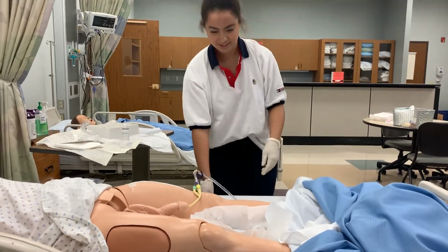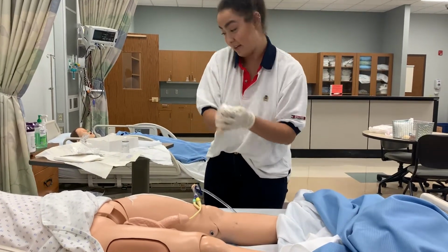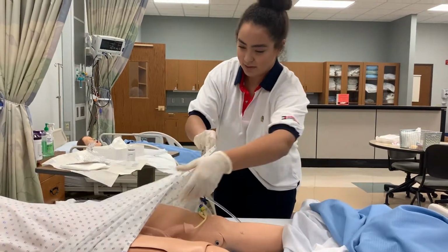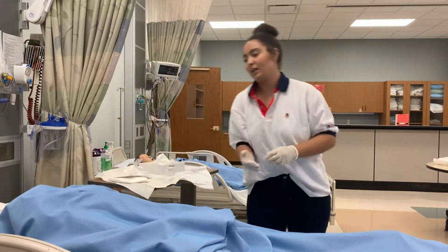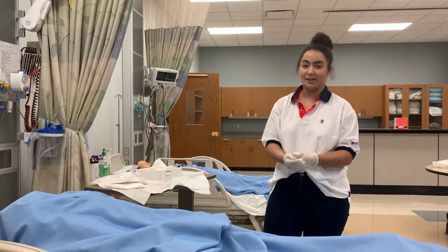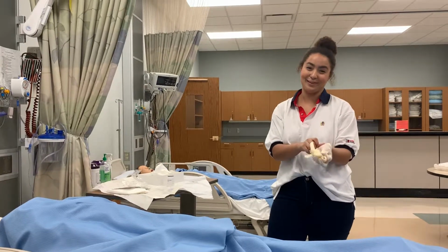All right, it's hung. All right, and I am going to clean up my space since I am no longer sterile. And I'm going to provide him with some privacy, and then I'm going to educate him on proper catheter care and how it's going to go. All right, that's it. I'm going to take these off for hand hygiene.